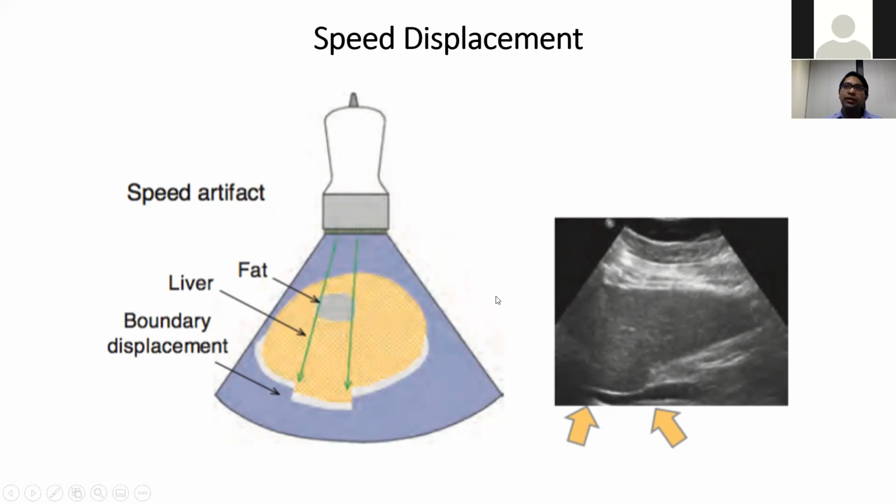We typically use a constant speed. However, good beamformers can account for local speed of sound and correct for these sudden shifts in the speed of sound.